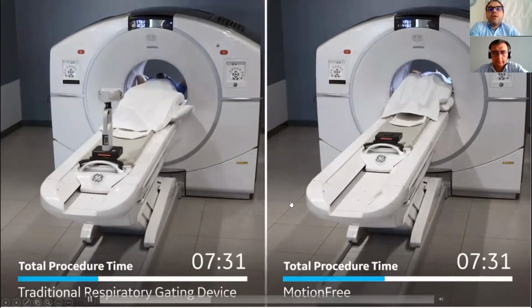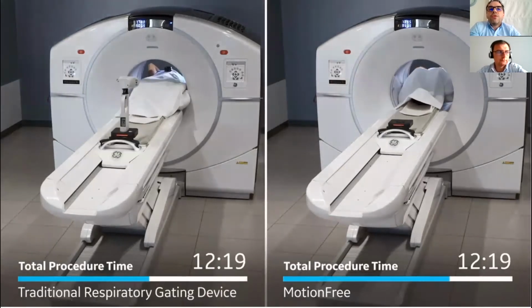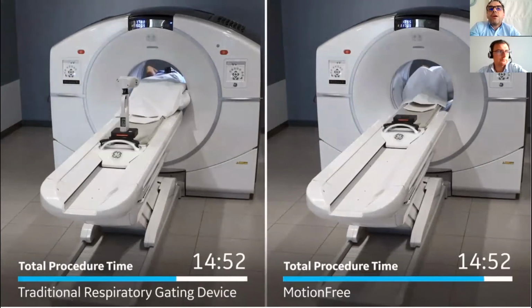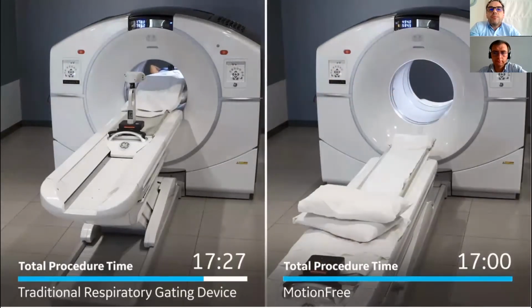So as you will realize, there is a big difference in the total scan time, which is very important, especially in case of a very busy department.